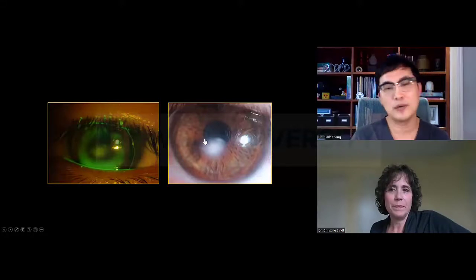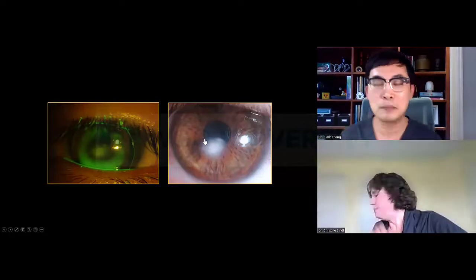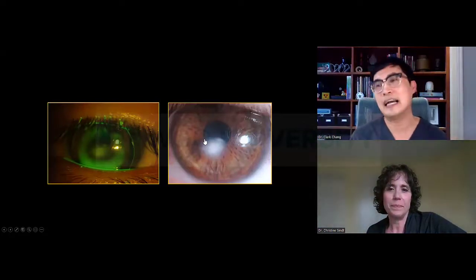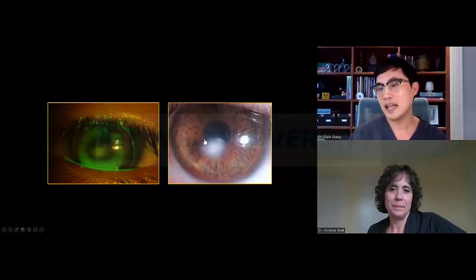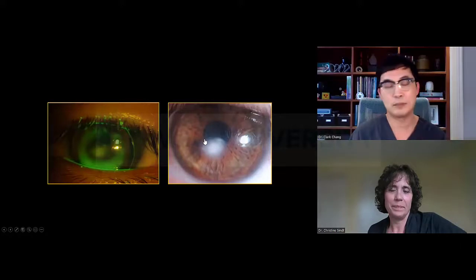So here's a patient who actually came in and said, I already know that I have corneal scarring. I was told that it occurred 3-4 years after I started wearing corneal GP, but I was wearing them too long, but I needed them to see. I had no other choice. And progressively, my vision has gotten worse. And now I'm being told maybe corneal transplant because of my history of corneal scarring. You're my last try. Is there anything that you could do before I go get a corneal transplant in both eyes, because it's similar in both?